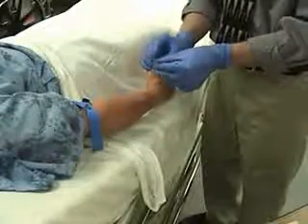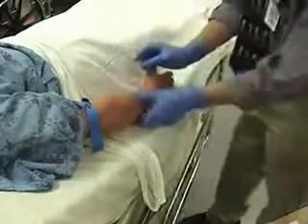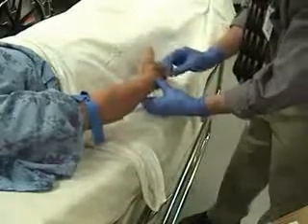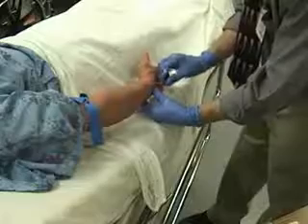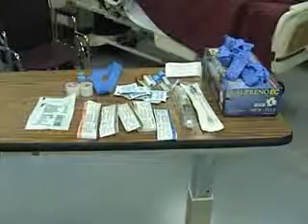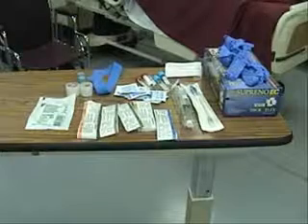Learning to start an IV can be a daunting task for any nursing student, but with the right technique and lots of practice, you will be able to start IVs with confidence. The first step in starting an IV is gathering all the necessary supplies.